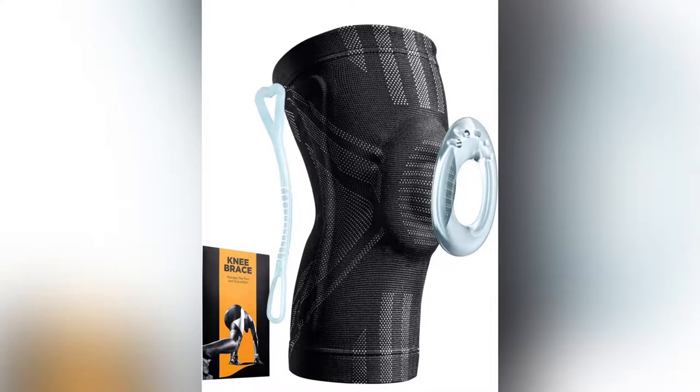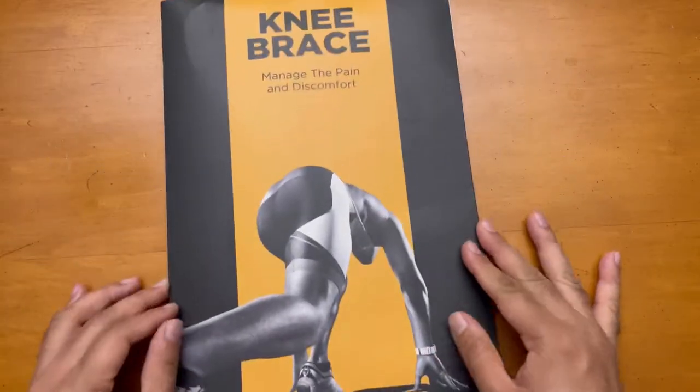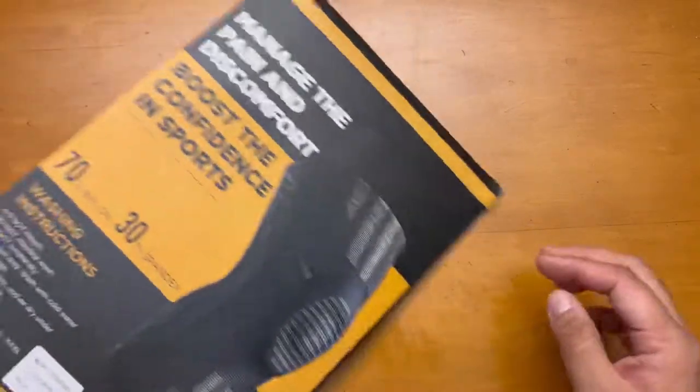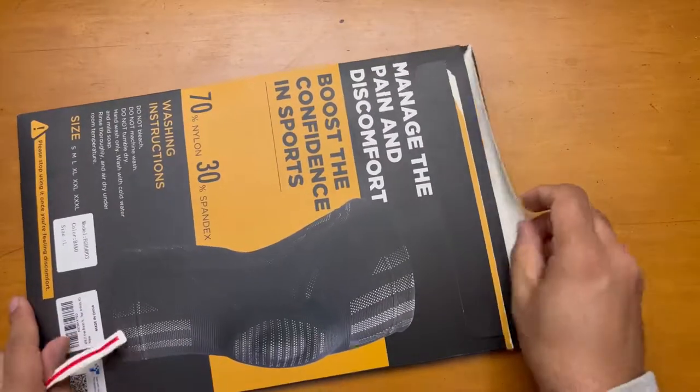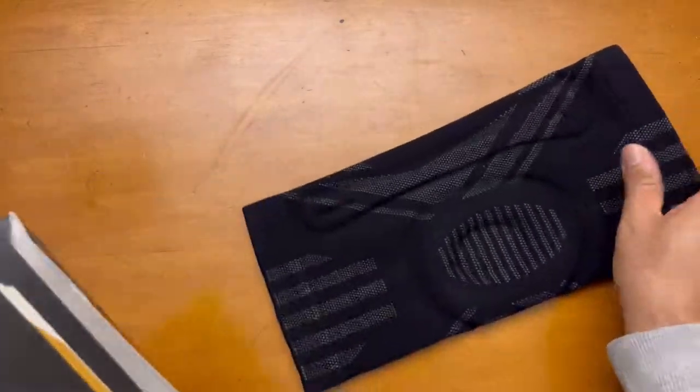Hey guys, I'm showing you this kneecap — this is a very protective knee brace. You can see it has two plastic supports on the side and one kneecap in the plastic, which is a flexible one.